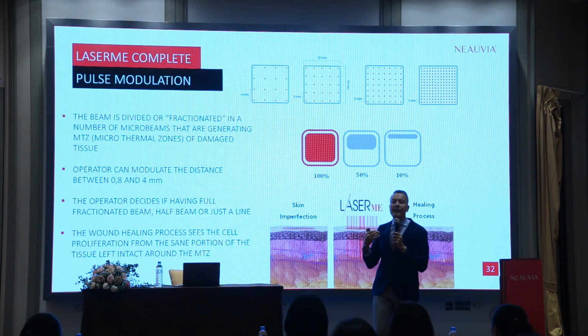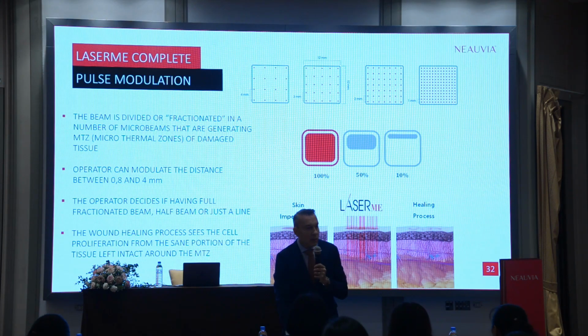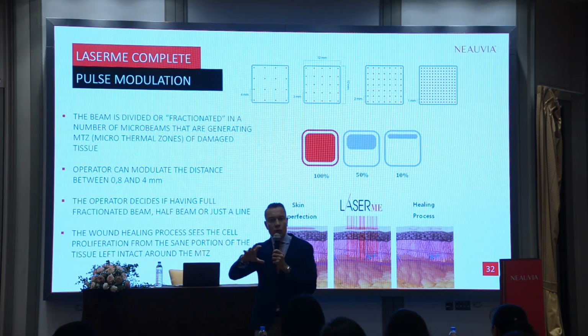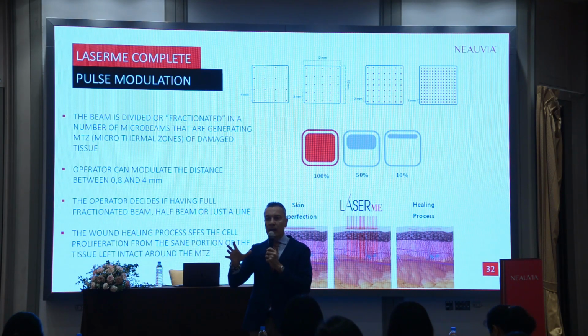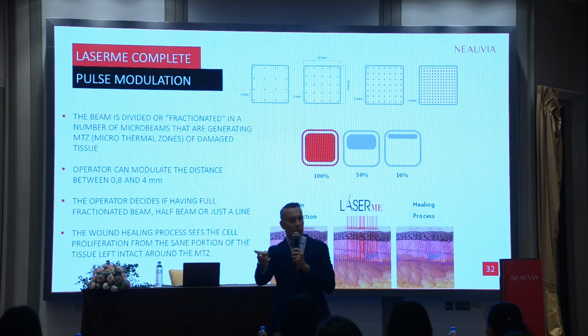Because whenever you enter a clinic, you will find a different scenario. So doctors not having any kind of laser for the skin. So you need to convince them that non-ablative is probably much more flexible, less risky, than having an ablative laser. Or you enter a clinic and you find a CO2 and an Erbium. So you have to convince the doctor that these are not overlapping.